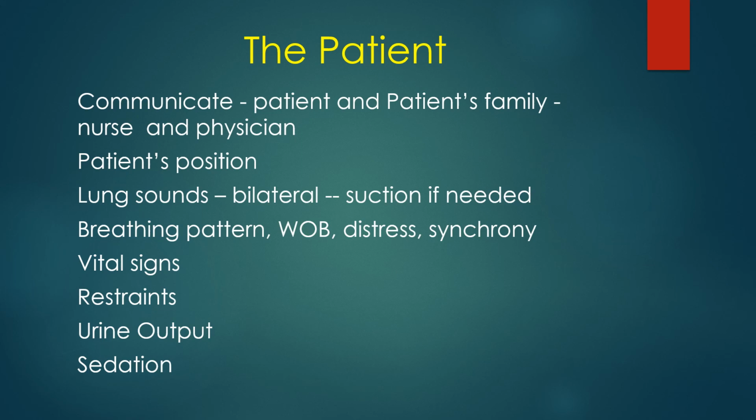And of course, you want to listen to his lung sounds bilaterally. You listen to one side and compare it to the other. You're listening for things like no breath sounds on the left side, which would happen if the ET tube migrated down the right main stem. And you're listening to see if he sounds like he needs to be suctioned.